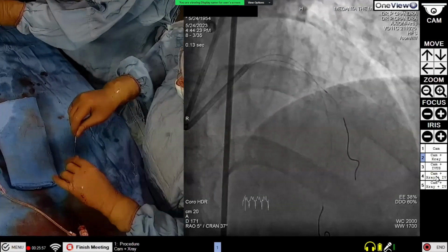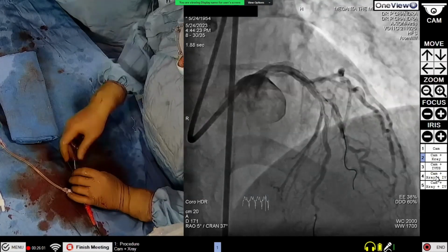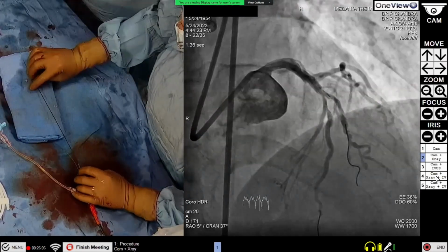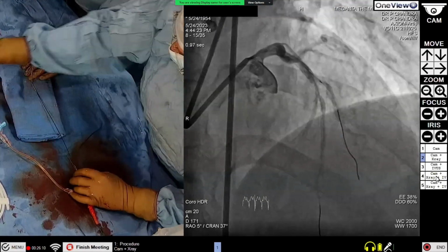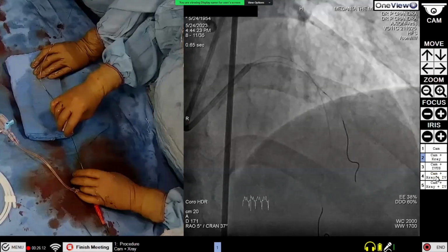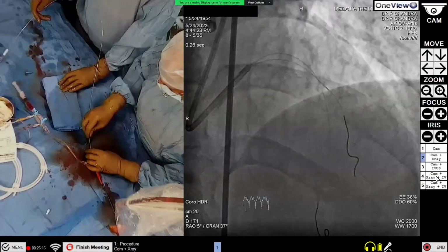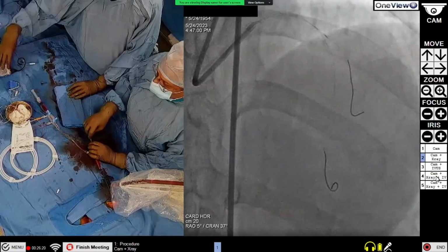He is happy with everything else except the stent. He may be right to some extent, but we told him we will try to avoid it as much as possible, while still keeping it as safe as possible. So here is the 3 into 12.